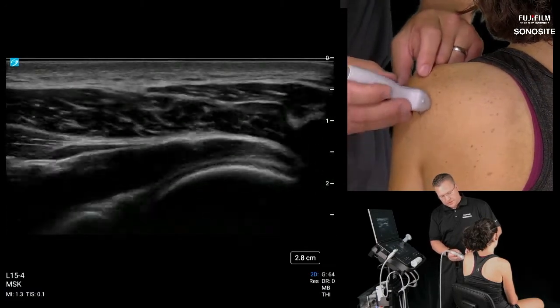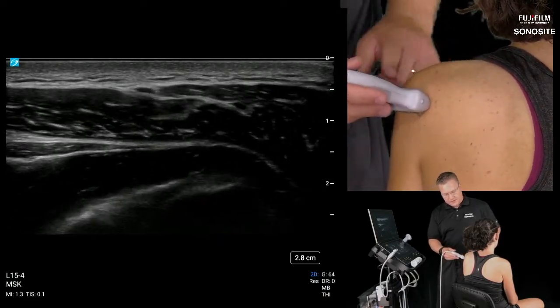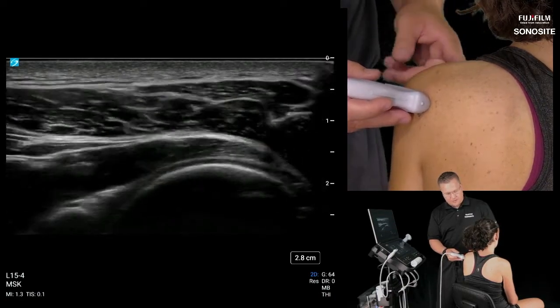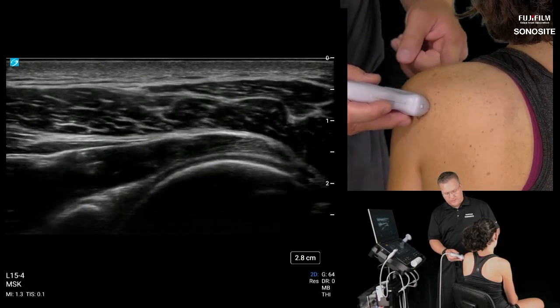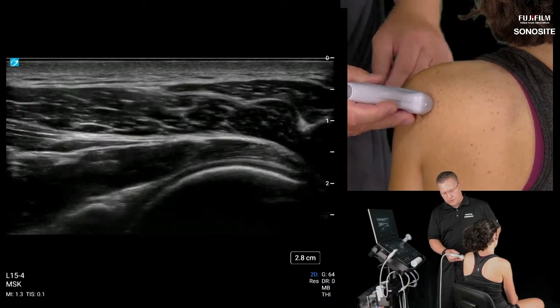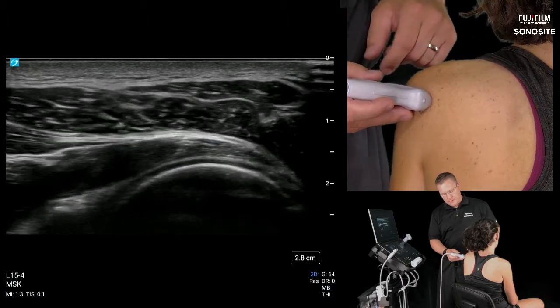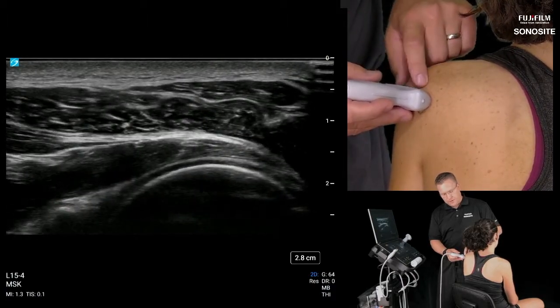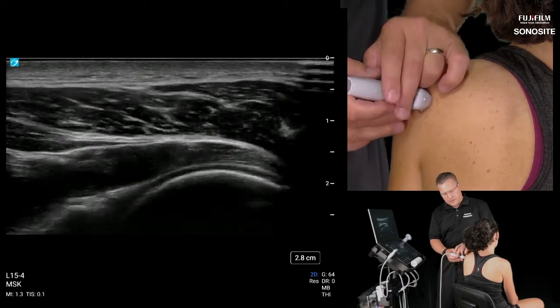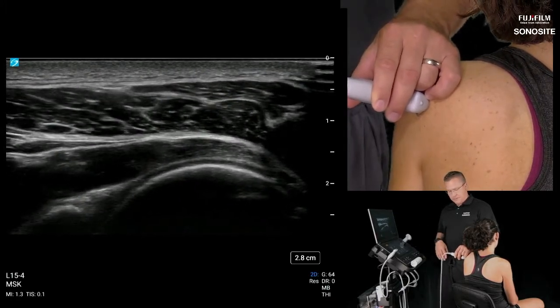And then if you're already doing injections in a shoulder, the direction of your beam will be relatively exactly like you do a glenohumeral joint injection. If you're not familiar with this anatomy, on the anterior part of the shoulder is the coracoid process, and you can feel that with your finger right up here, and you'll basically point your beam towards the coracoid. But the upper margin of the transducer is just rested against the inferior margin of that posterior lateral acromion point, this little prominence on the back. And then I'm just going to rest the palm of my hand on the top of the shoulder so I can scan comfortably.